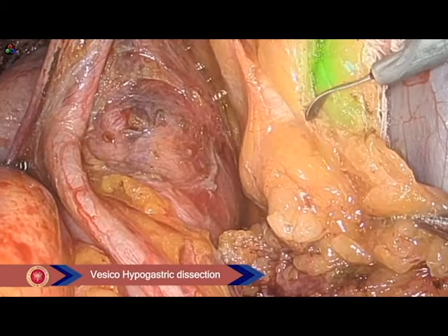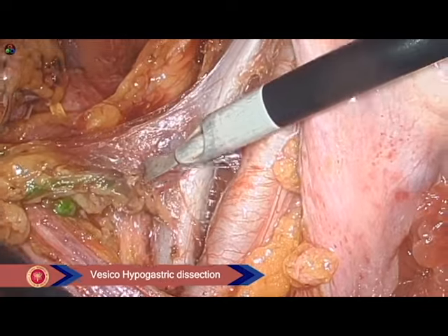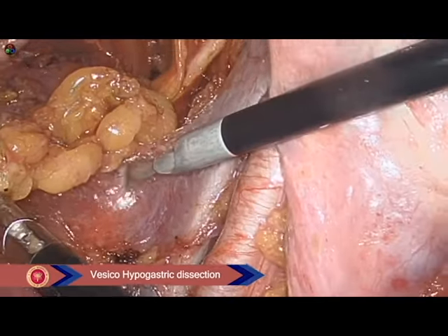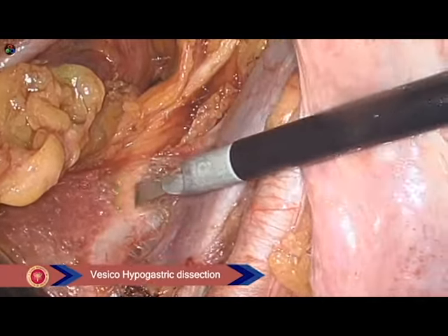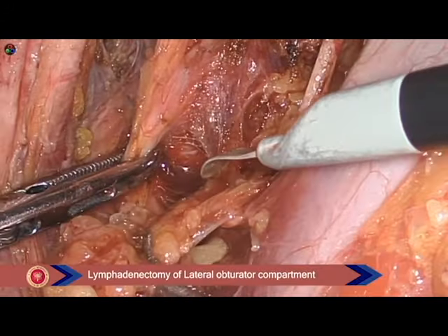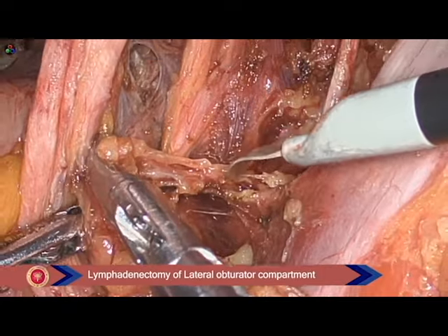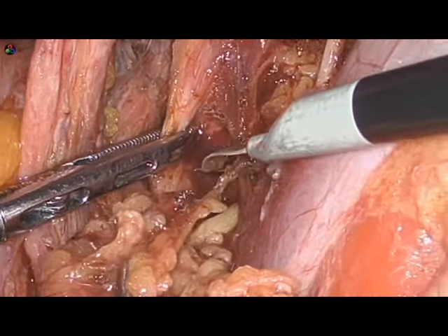The next step is the dissection of the vesico-hypogastric fascia, which surrounds the internal iliac vessels, the inferior and the superior vesical arteries. Dissection then proceeds along the lateral and the medial obturator group of lymph nodes.